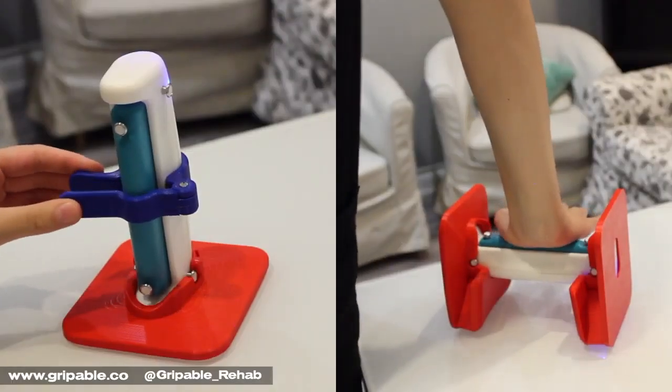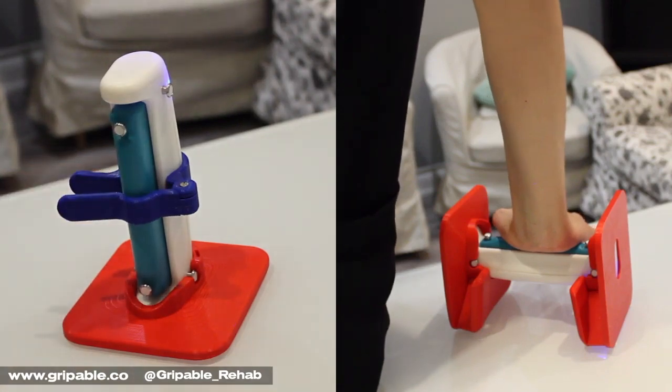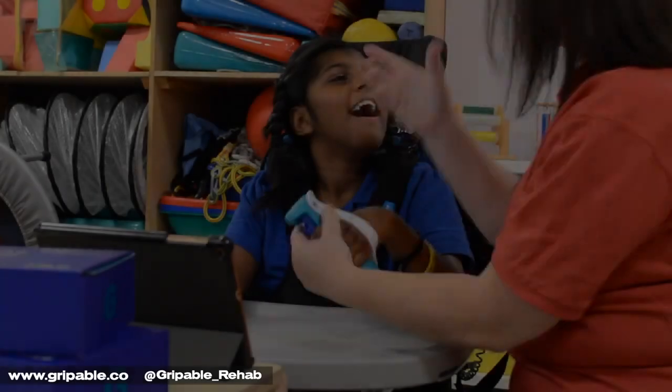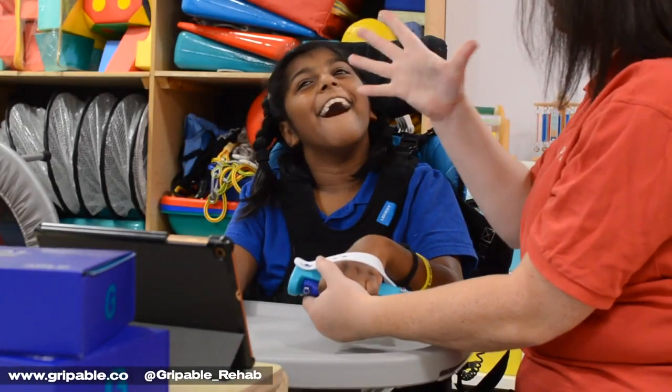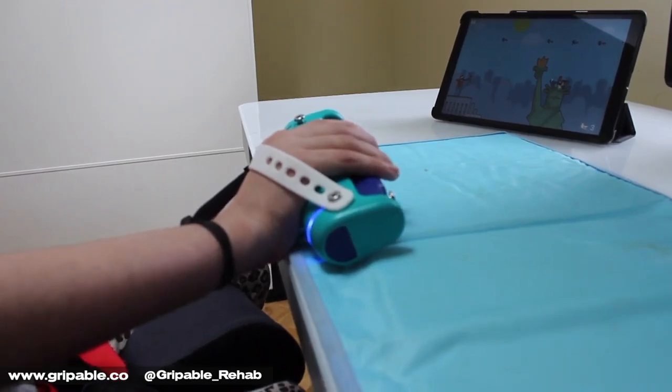Pinchable for pinch assessment and training, and Stable to stabilise the grip ball horizontally and vertically, are both in design. Our portable device can be set up in clinic and continued from hospital to home, and is ideal for remote management.